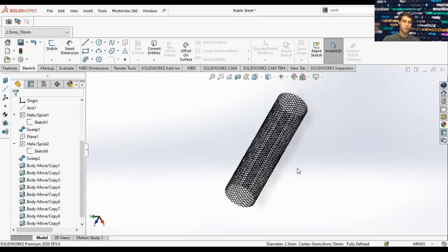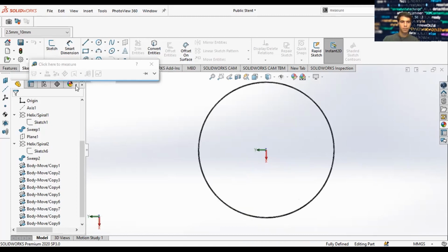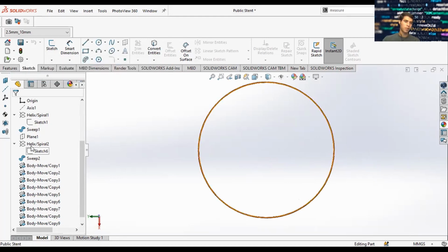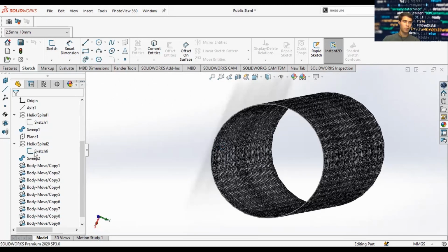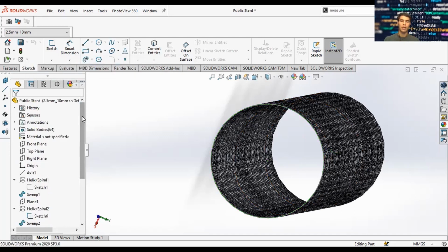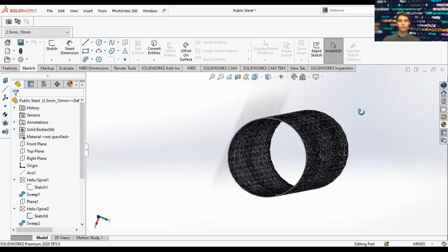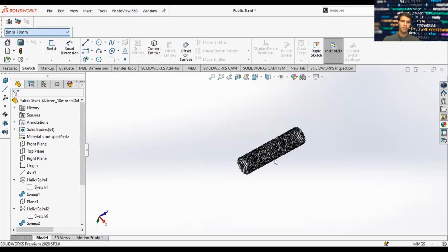And to prove to you that this is actually the case, we're going to measure. I'm going to measure this. Awesome. Maximum distance. So the area and perimeter, it gives the value 1. So go ahead, measure the circle. Show the circle. This ends. There's a circle. We're going to measure that. Diameter 2.5. So we did that under configurations. We basically made 3 separate objects, and within each one we can make configurations or modifications of the same base object. Let's go ahead and add this sketch. So there you go. You have a 2.5 and you have a 5, which is this one.